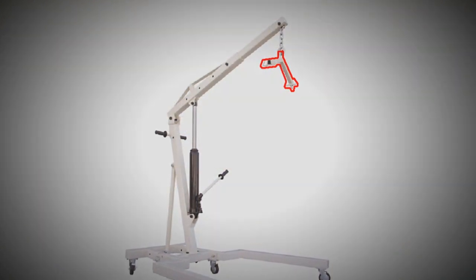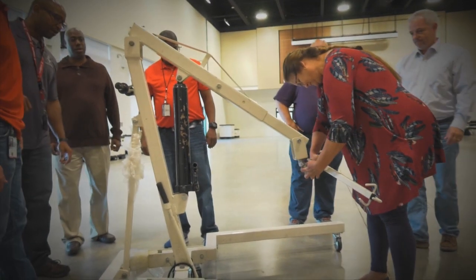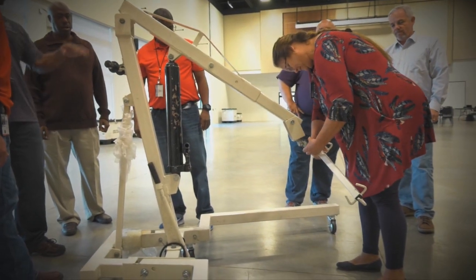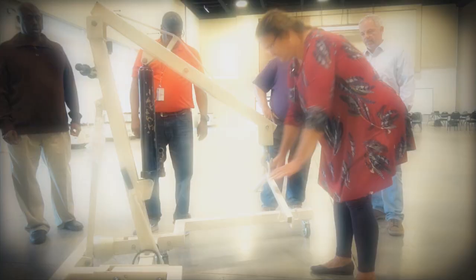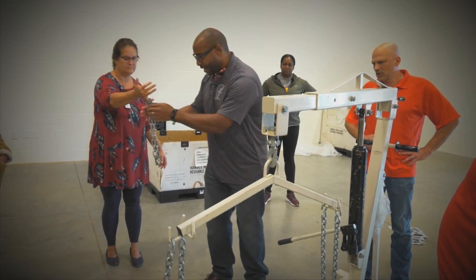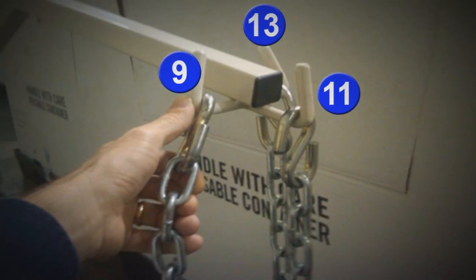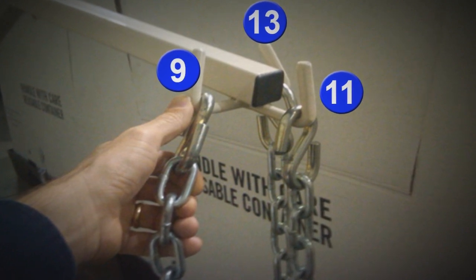Next, attach the cradle or trapeze bar to the hook at the end of the extension arm. Attach the six hook chains onto the end of the cradle or trapeze bar. The numbers shown here refer to the links in each chain.